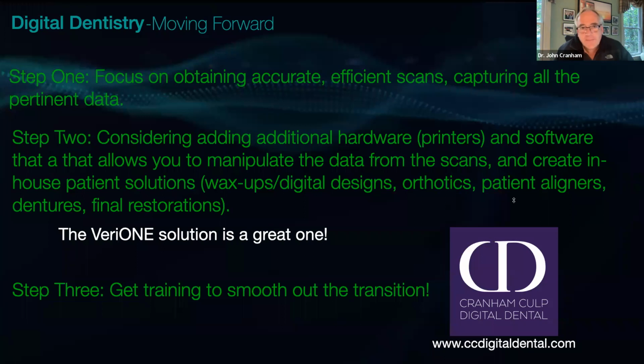So there are some other ways to kind of get around it, but like I said, I haven't really run into anybody yet that doesn't have a denture. Now, the easiest ones to do are actually the immediates. When they've got a few teeth, as long as the teeth occlude at some vertical, you can scan the whole arch, upper and lower, and have them bite and scan that.